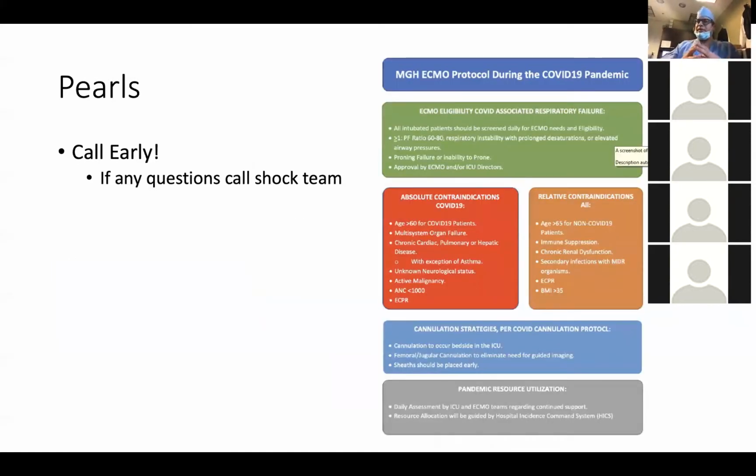Finally, call early. Any questions, call us. We want the person on our radar. We have a whole protocol in place. You've got many emails about management in the ICU workflow around proning. I want to highlight the fact that our contraindications to ECMO, unfortunately, are more strict. But again, always call. It's MGH. We'll evaluate each patient on a case-by-case basis.